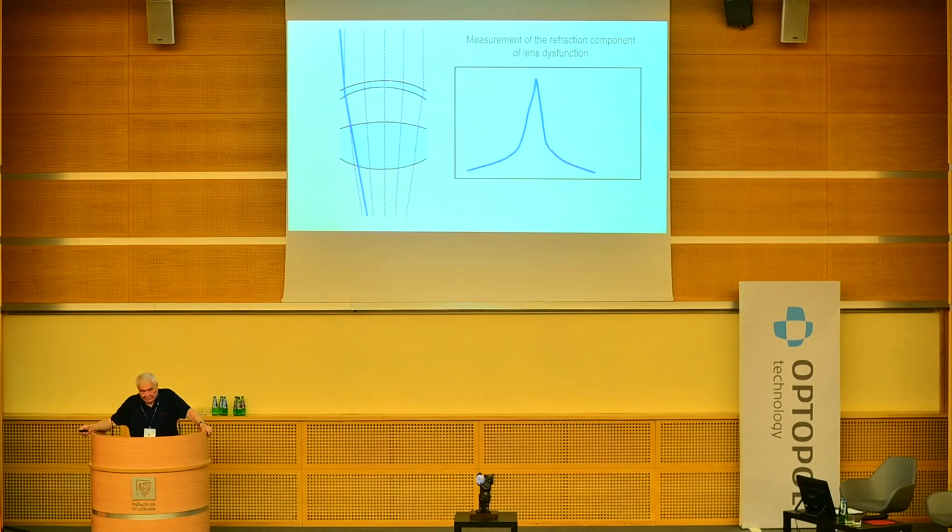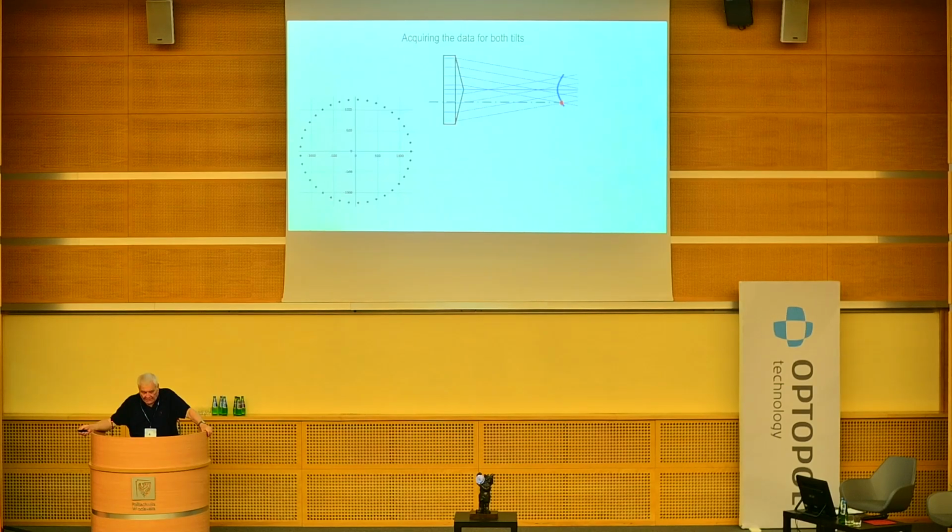Then you make another probing, you get another coordinate on the detector, and you go through each point of entrance. If you have, for example, a circle of points at the entrance to the axicon, and you project the tilted beam, blue beam, which is tilted, you get the projection on the retina. Then you project another tilted beam, and you get another projection.